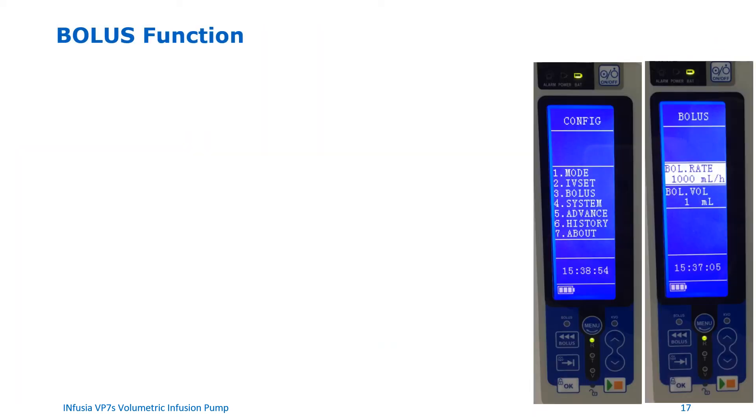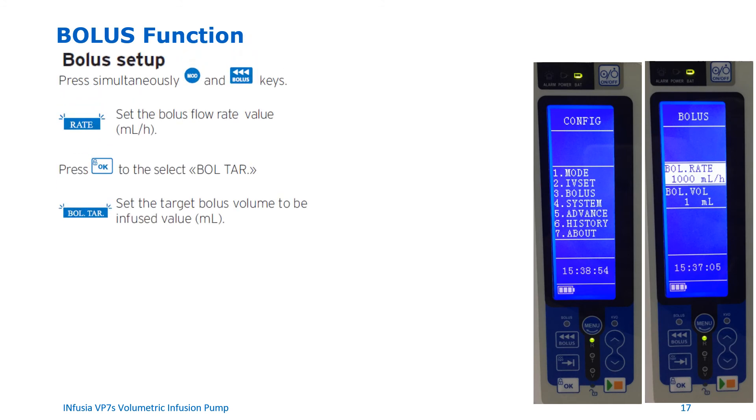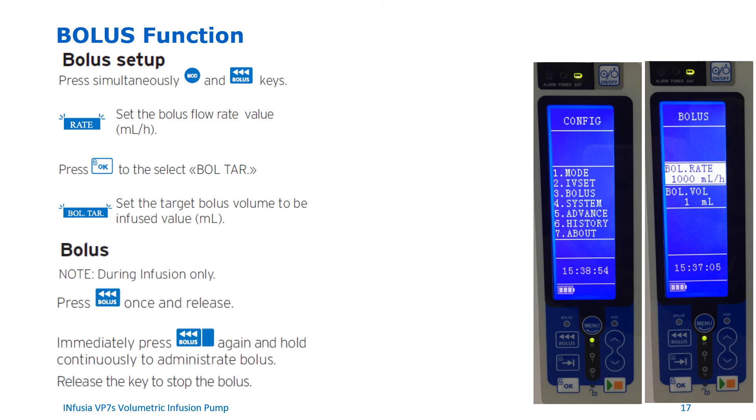Bolus function. To set up and program a bolus dose, press both the MOD button and the bolus button simultaneously. Set the bolus flow rate value in mL per hour, then press OK to select the target bolus volume in mL. Set the target bolus volume to be infused, then press the start/pause button to start the bolus. You can also deliver a bolus dose while running an infusion by pressing the bolus button once and releasing, then pressing it again immediately and holding it continuously to administer the bolus. Simply release the bolus button to stop.